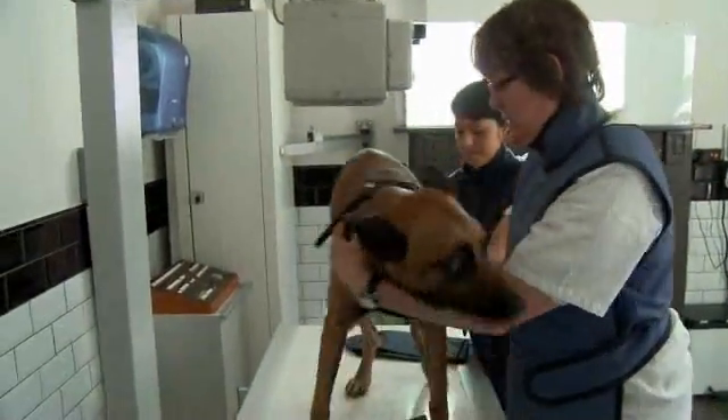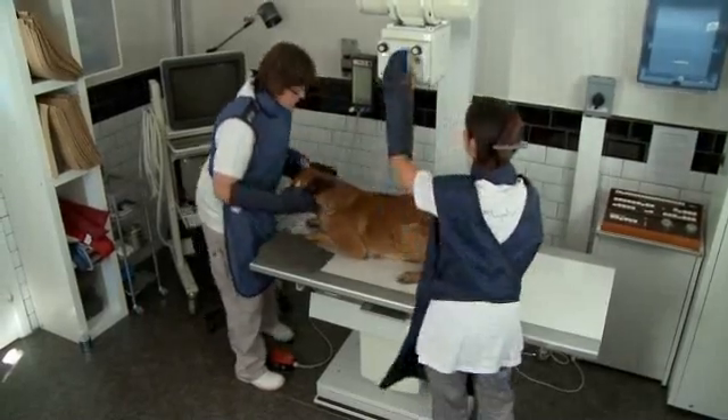Once the dog is on the table, we will remove his collar to avoid metal artifacts on the film. When positioning this dog for this view, we try to get perfect alignment between the vertebral column and the sternum.